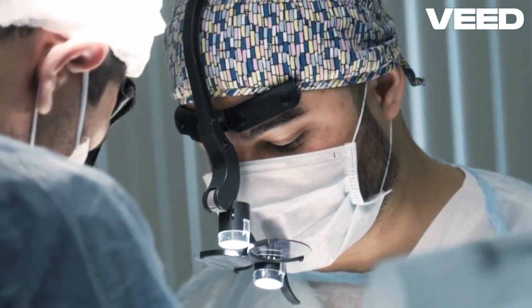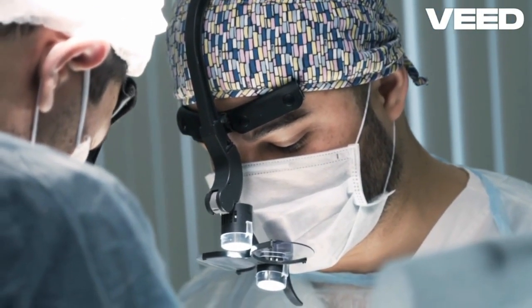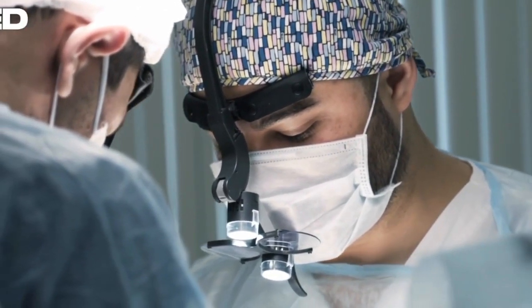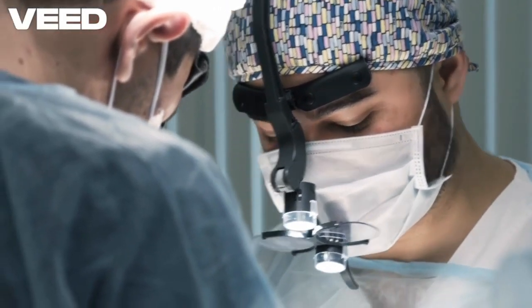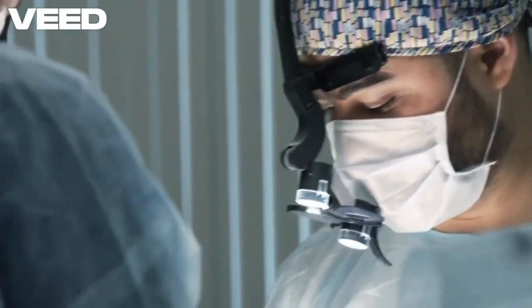The procedure generally involves these key steps. After making an incision behind or in front of the ear, the surgeon elevates the ear canal skin to access the perforated eardrum. The surgeon prepares the graft, often using the patient's own temporalis fascia or cartilage, harvested near the ear.